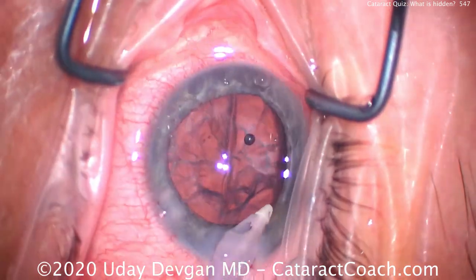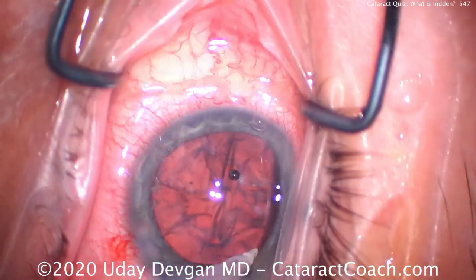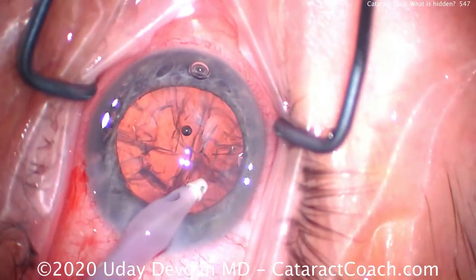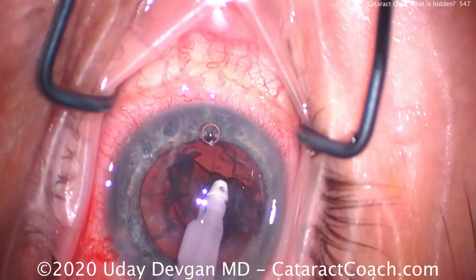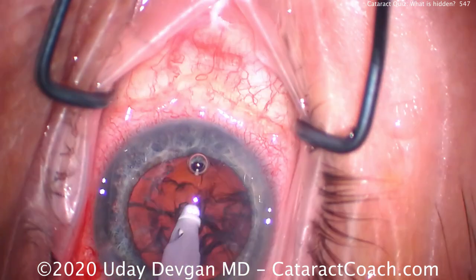We'll do our cortex removal and I try to get it out a little bit, but I'm really not getting much success using the IA probe here. Trying to get that piece out — it doesn't come out. Don't be fooled into thinking that it's fine. It's still there, just wedged in the angle of the eye, and because of all the dispersive viscoelastic it's being held there.